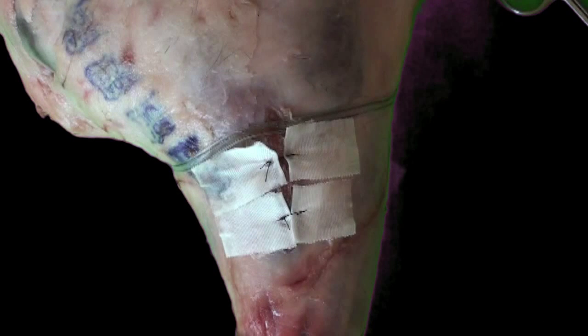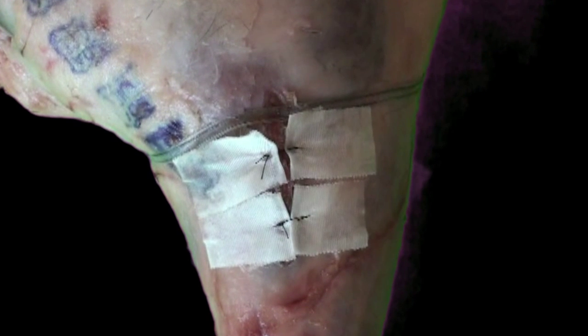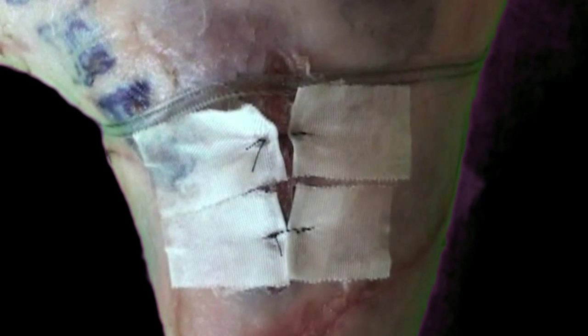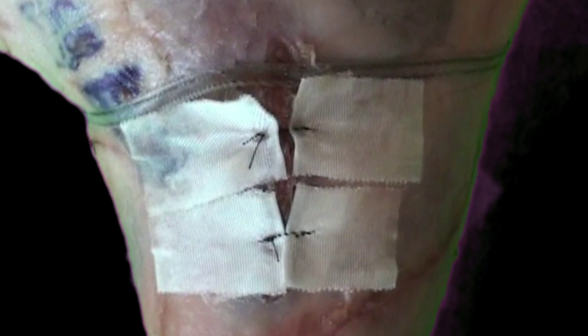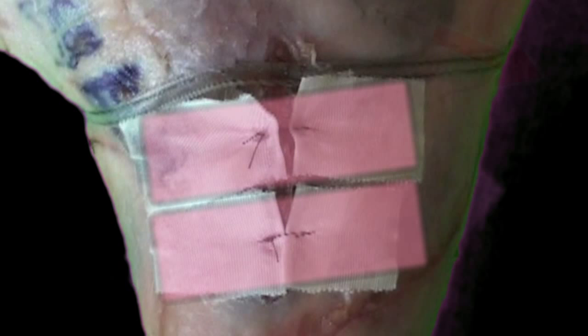This is a good technique for your needle-phobic patients, but it's also especially useful for wounds that are under a lot of tension. If you bring together a wound like that with only sutures, all that force needed to pull the wound margins together is distributed in a narrow band of suture that's pressing down into the tissue and is a lot more likely to cause ischemia underneath. With this method, the force is distributed over a much larger area and there's less tension on any one part of the wound.